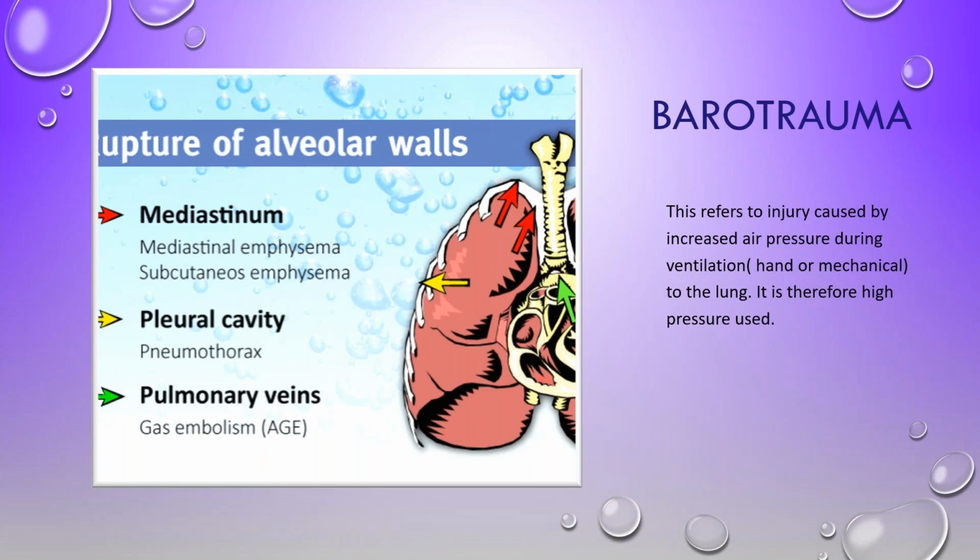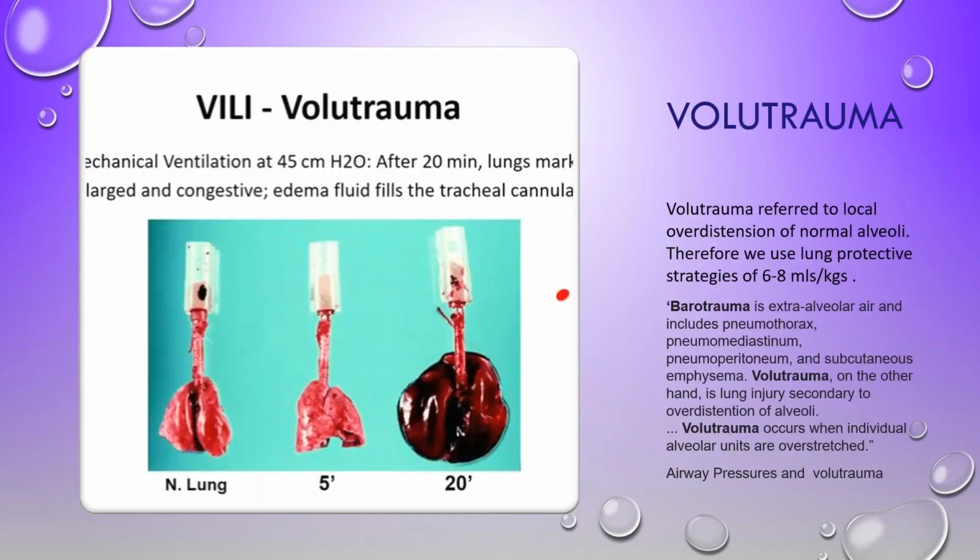A rule of thumb is every finger that you put on that bag valve mask resuscitator is 10 centimeters of water. It is therefore better to use the so-called pressure-limited resuscitators, if that makes sense.